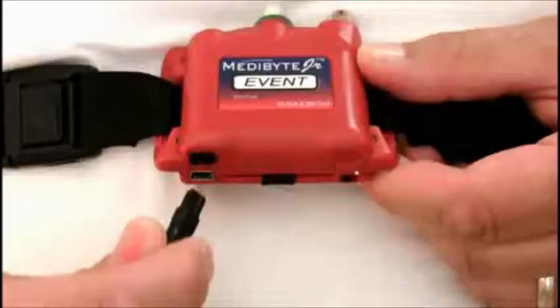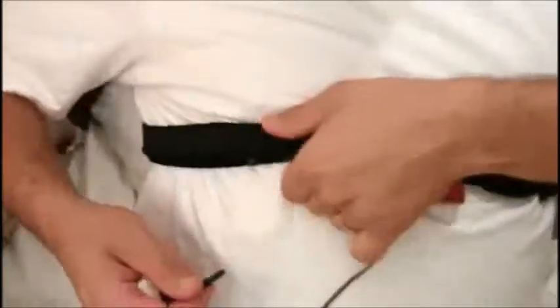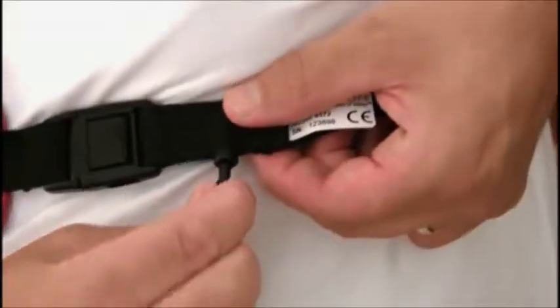Now, connect the belt sensor cable to the bottom of the unit, then insert the two ends of the cable into the plugs located on the belt on each side of the MediByte unit.